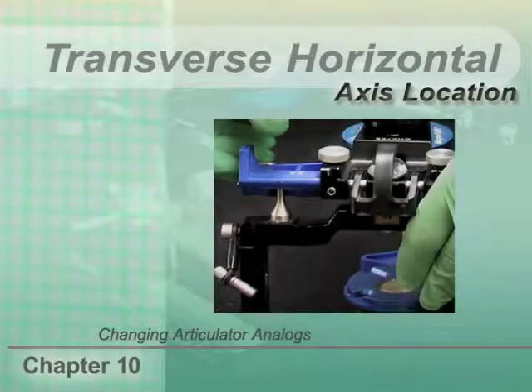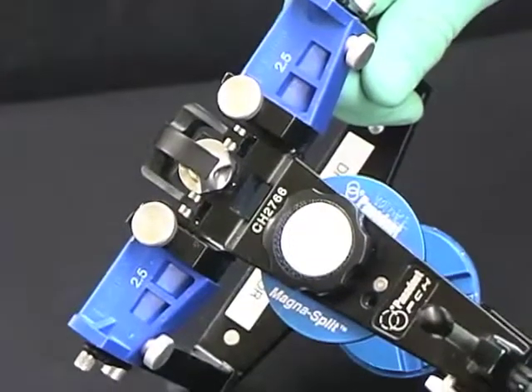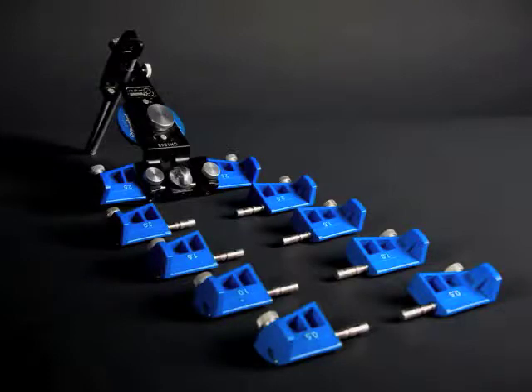Changing articulator analogs. In developing the Panadent system, Dr. Bob Lee studied condylar movements extensively. In his research, he made up custom motion analogs for individual patients. He ultimately discovered that he could make generic analogs based on the Bennett side shift of the condylar movement.